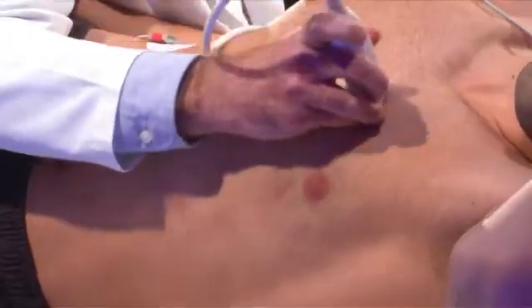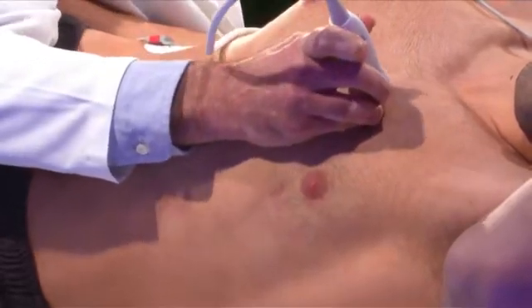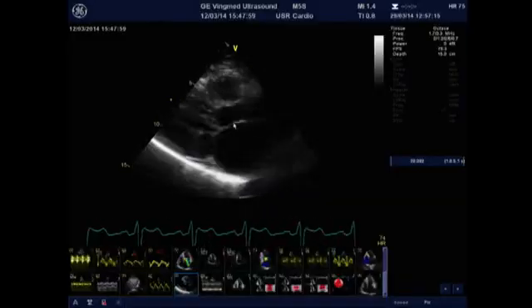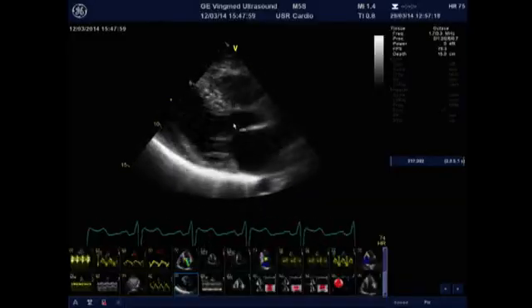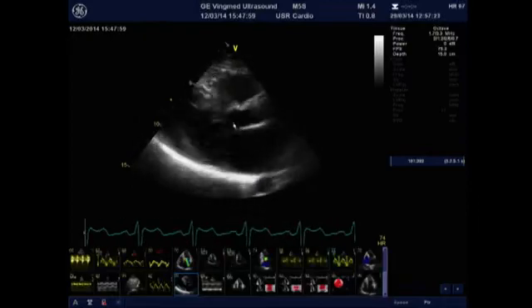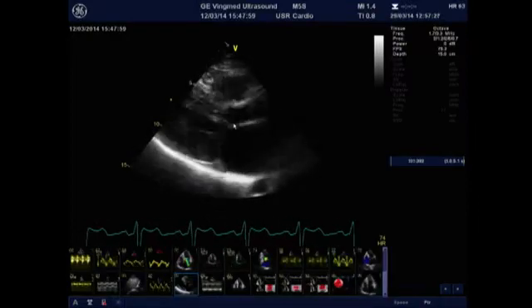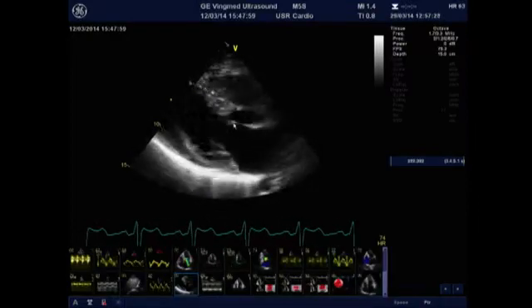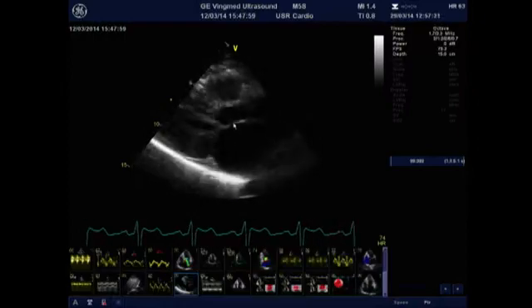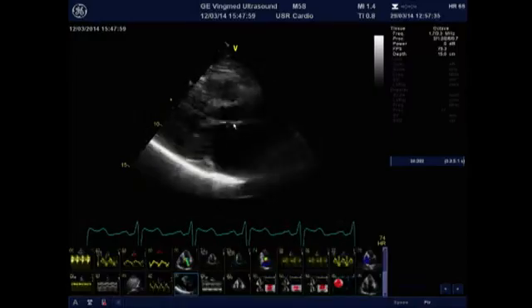And now we're going to change the view and turn again to the left parasternal view to assess systolic function. In the eyeball assessment, everything seems to be contracting well. We know that the classical indices of systolic function in this disease show that these patients have normal or even supernormal systolic function.